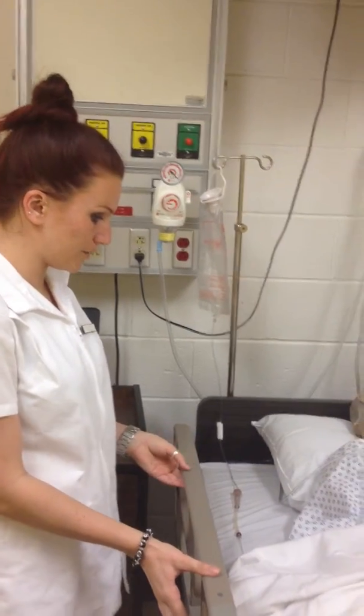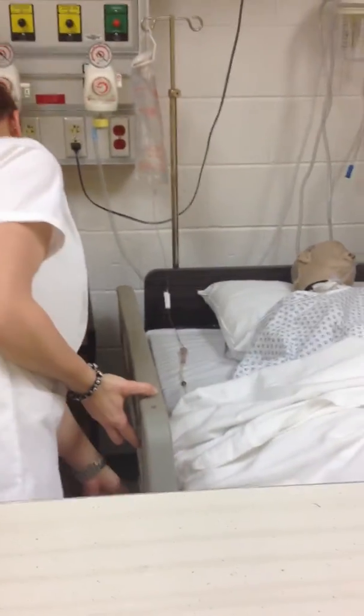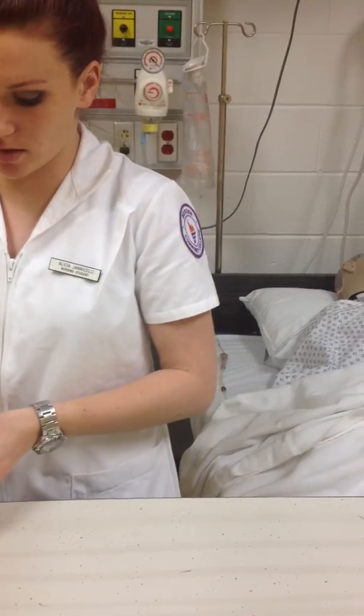I've washed my hands. I'm coming in the room. I'm going to bring the bed to a working height, and I'm going to bring this down. And we're going to get started on our sterile field.